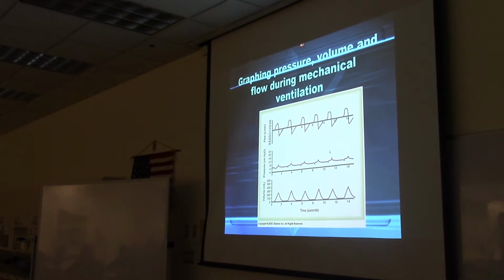All right, it helps when it tells you what the graph is. So if we're looking at flow rate, the 0 is the baseline. Everything above it is when the air is flowing into the lungs. And everything below baseline is the air coming back out. So here the patient's exhaling, all the air is coming out, and when it hits 0 or baseline, all the air has exited the lungs.